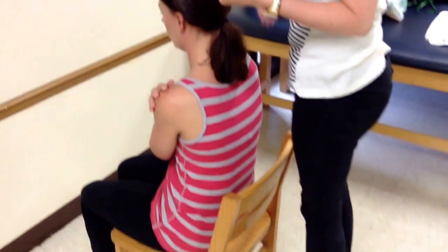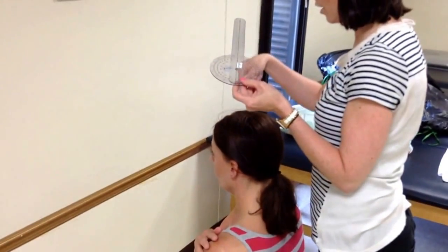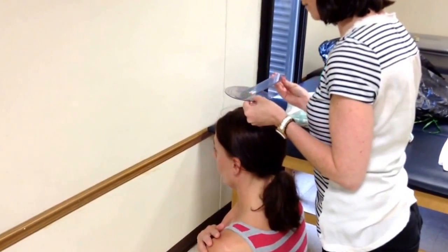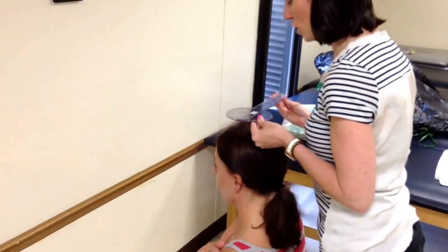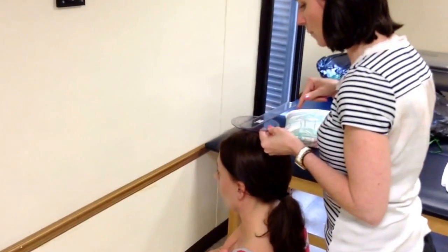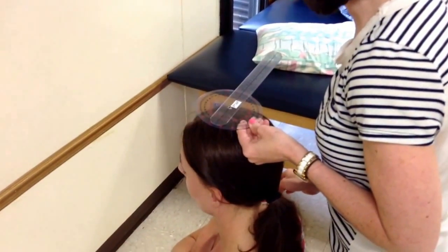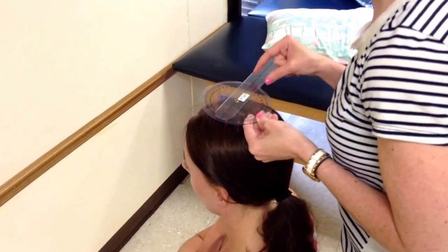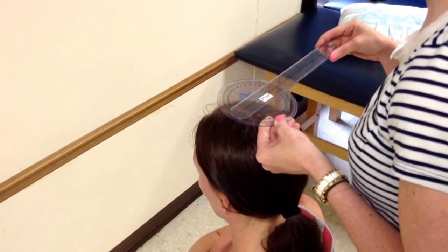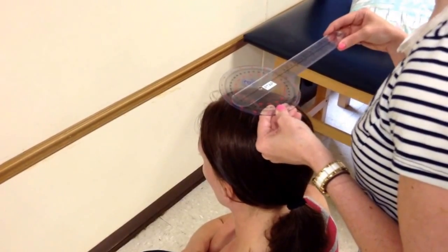I need to stand on a stool behind the patient. The fulcrum goes in the center of the cranial aspect of the head. The stationary arm is parallel to the imaginary line that connects the two iliac crests. Since that's hard to see, I'm going to assume that the line connecting the two acromion processes is parallel to the line connecting the two iliac crests. I palpate the acromion processes, then line up the arms with the tiles on the floor so that once she moves, I know my stationary arm has not moved.